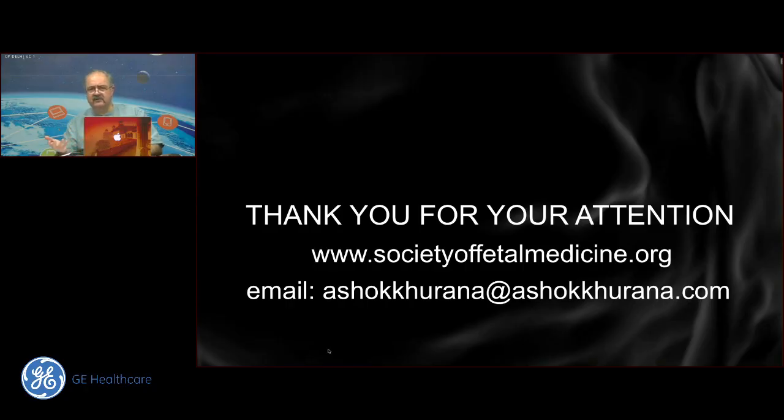You will look at ureters, you will look for kidneys, you look for associated abnormalities, you look at the portal vein, you look at the umbilical cord, you look at the angle that the umbilical vein makes with the rest of the system, the key sign like I said, you will look at the urethra, you will look at the genitalia and so on. But essentially, if you are not sensitive to a bladder that doesn't fill, you're going to miss this diagnosis. It's not a crime to miss this diagnosis.